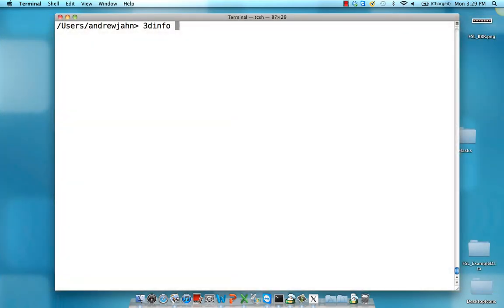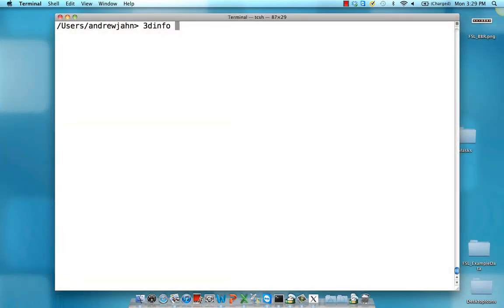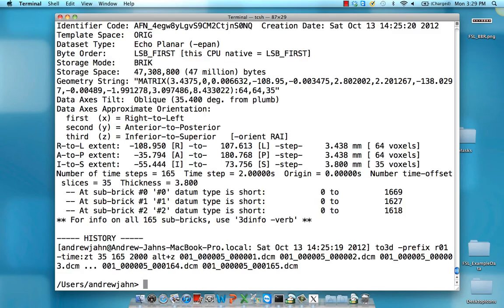The use of 3dinfo is straightforward. Just type in 3dinfo followed by the name of an input dataset. In this case, you can see information about the number of voxels in the X, Y, and Z directions, the size of those voxels, and things like the number of time steps or volumes in a dataset.